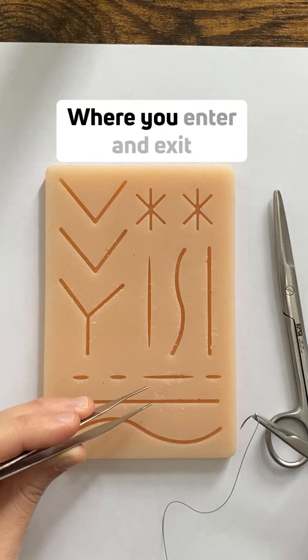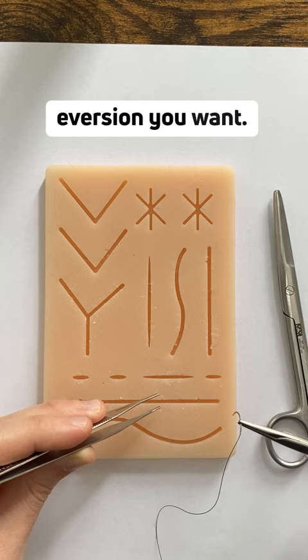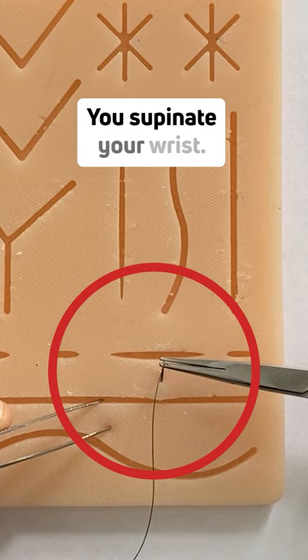Where you enter and exit will depend on how much eversion you want. Let's say you want to start at around one centimeter, at a 90 degree angle like before. You supinate your wrist and come out at around the same distance that you entered.